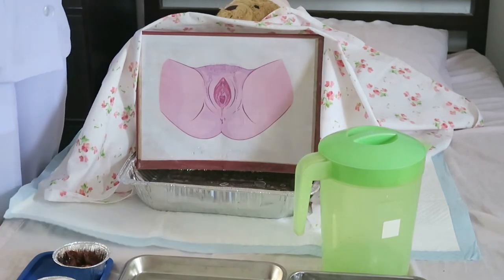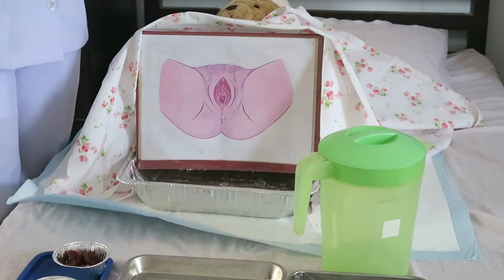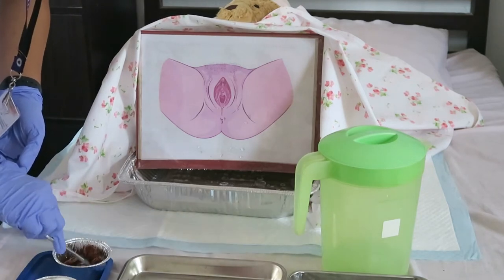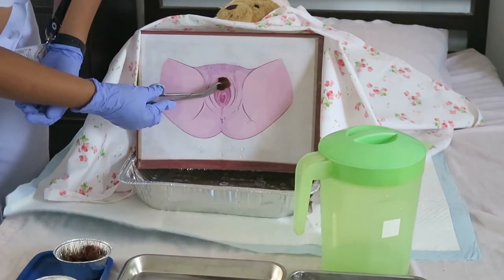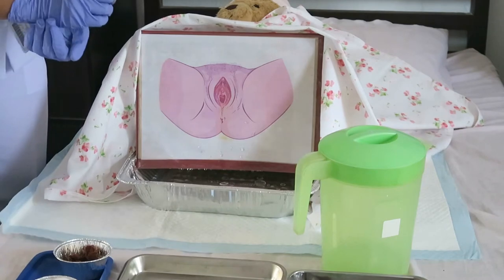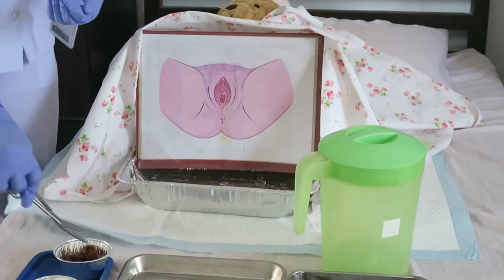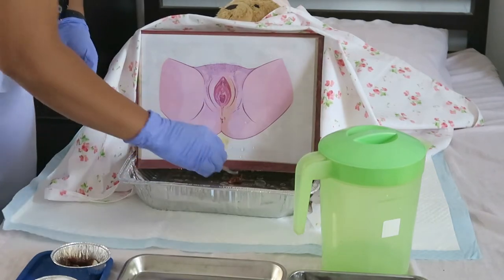Next, get a cotton ball with soap or cleansing solution using pickup forceps. This is to maintain sterility. Cleanse the external genitalia starting from the midline of the symphysis pubis down to the anus. Never retrace a stroke — this is to prevent contamination of the area. Ma'am, I will now start cleansing your perineal area. With the second cotton ball, cleanse starting from the symphysis pubis in a figure-seven stroke by way of the external labium forward to the anus, then discard.